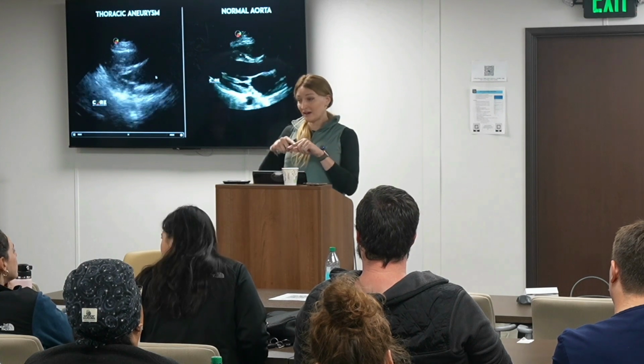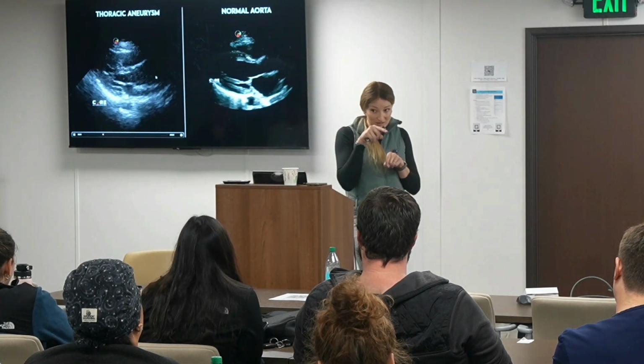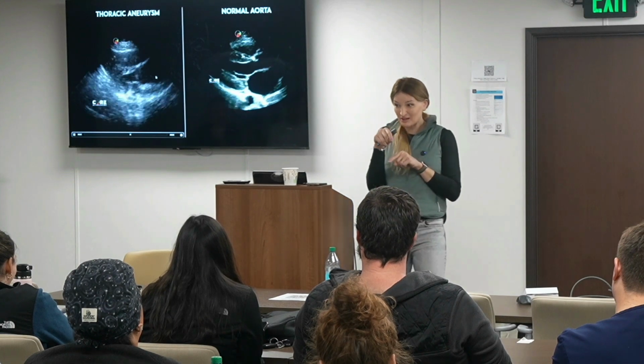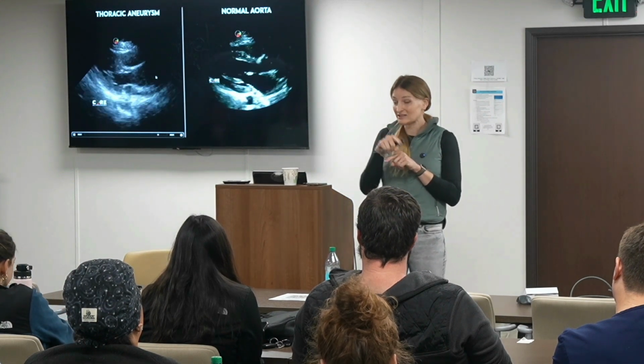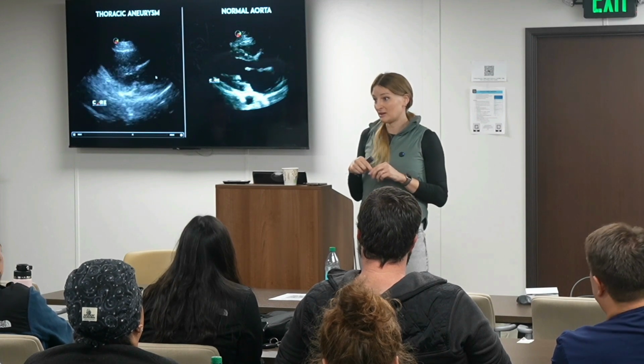So the average diameter of the left atrium is 4 centimeters. I don't really measure it or get concerned about it unless I think that the aorta is bigger than the diameter of the atrium.